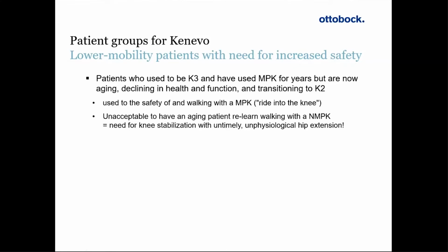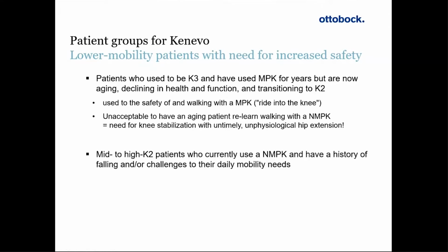I think that is a patient group where even the medical directors of the DME MACs know that there is a challenge and that there is an issue. And I think they're open to a discussion to keep these patients on microprocessor knees, even if they're no longer classified as K3 patients.